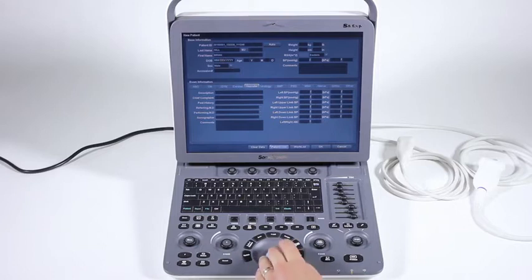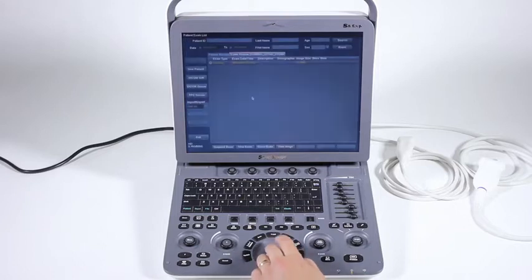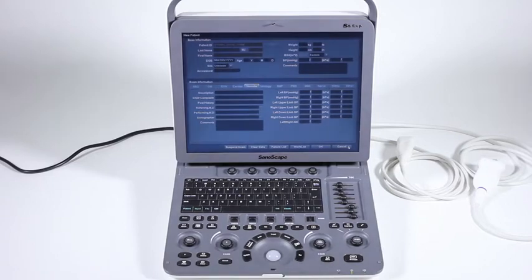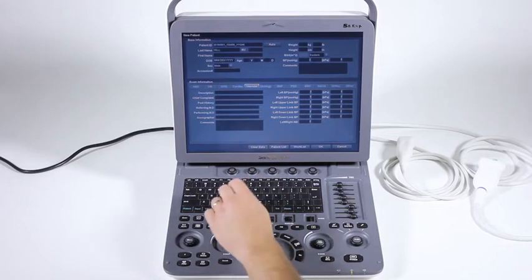If we go down to patient list, this will show patients that have already scanned. And you can close, suspend that exam. Exit, go back to patient. Now since I didn't save that, it has that current patient up there. So I'm going to go ahead and click clear data again. I'm going to click auto, start a new patient, type in the name.